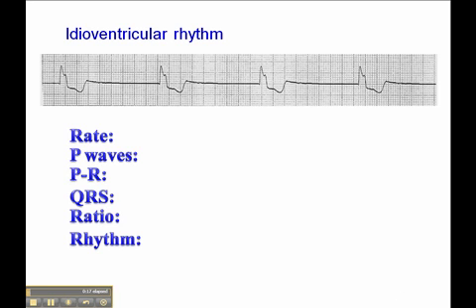Consequently, the heart rate is typically slow because the inherent rate of a focus firing from the Purkinje fibers is between 20 and 40. If you had an idioventricular rhythm where the heart rate was above 40 but less than 100, we call that an accelerated idioventricular rhythm. That's the most common reperfusion dysrhythmia seen in patients having an acute myocardial infarction who receive reperfusion therapy such as thrombolysis.